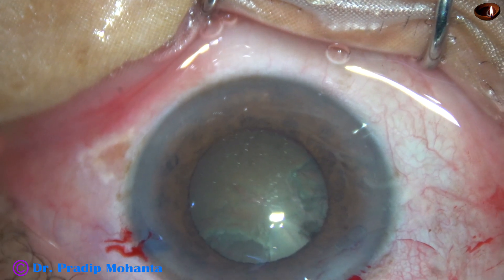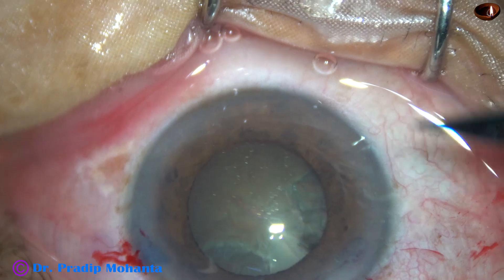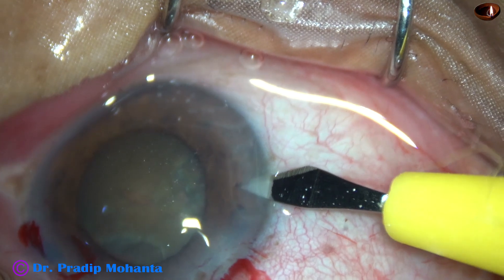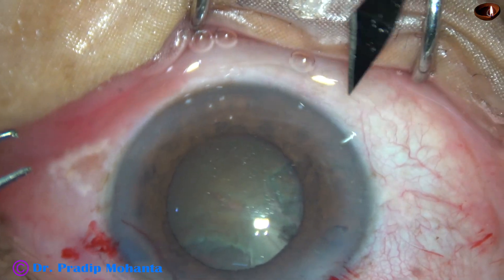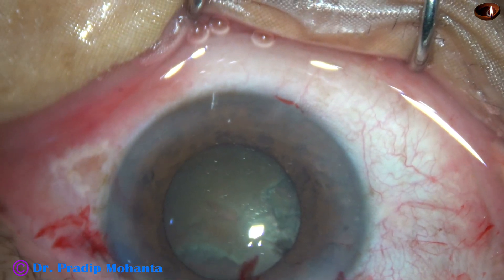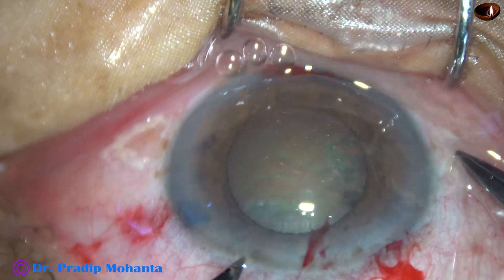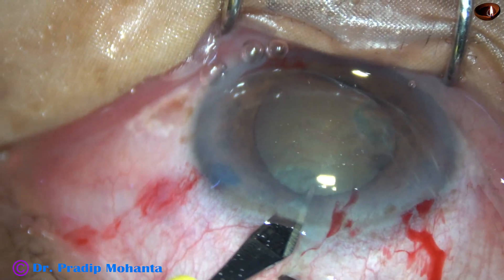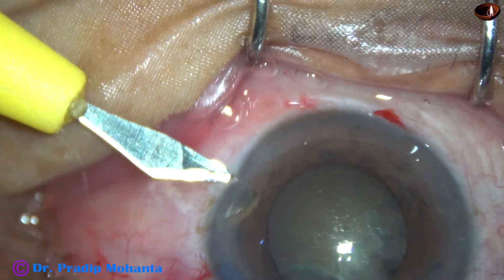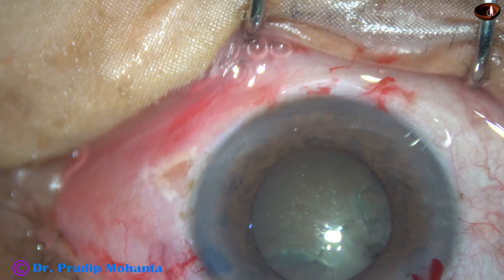I ask for a lancet knife and make four stab incisions. This is a stab incision at around 10 o'clock, another one at around 7 o'clock, another at around 2 o'clock, and one more stab incision at around 4 o'clock — so four stab incisions in total.